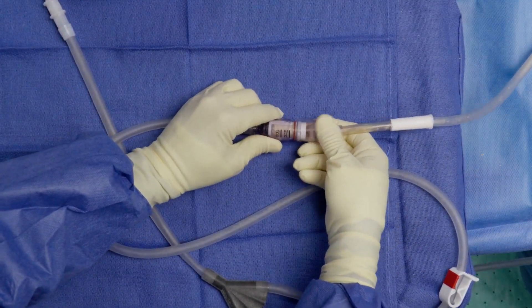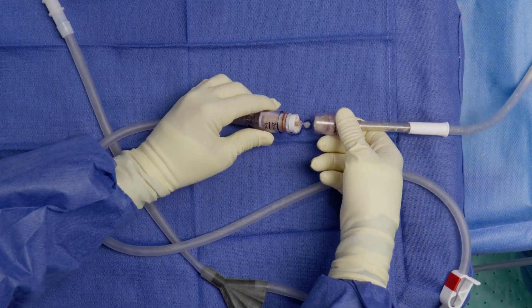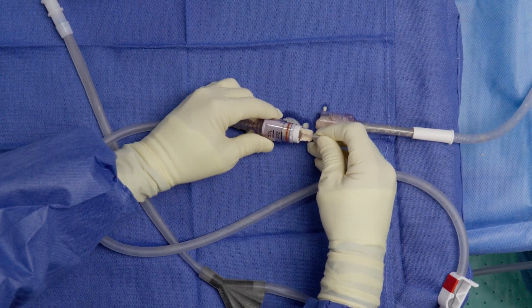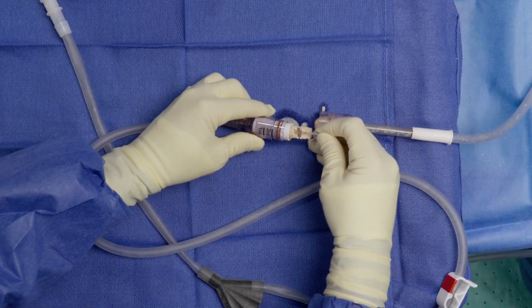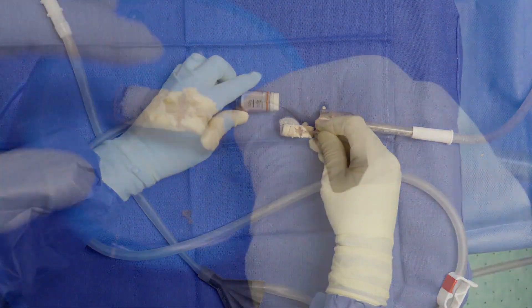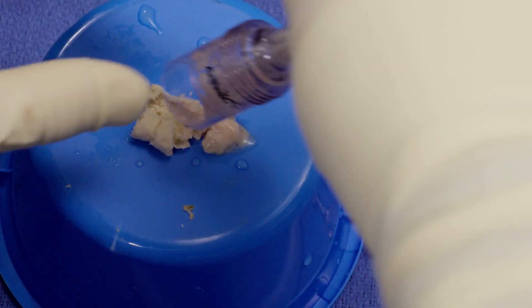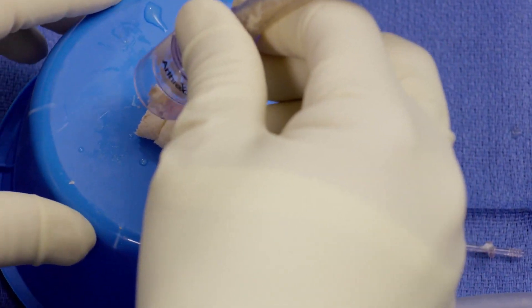Once the graft net is full, you can remove the bone graft simply by taking the top off the device, removing the plunger, and then shaking off your bone graft from the plunger. There typically will be some shavings still left in the top that you can then dump out as well.